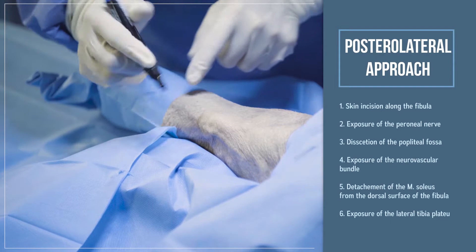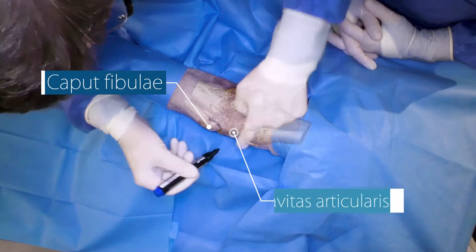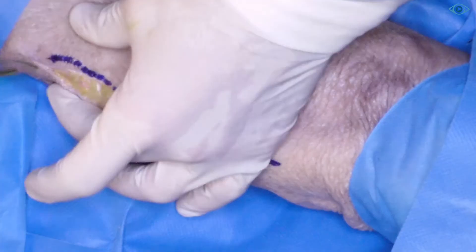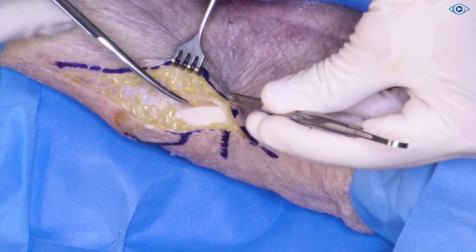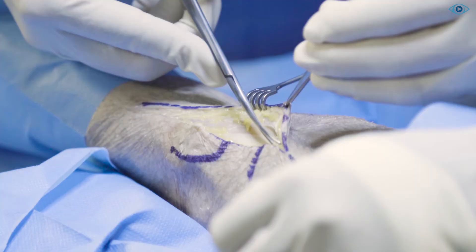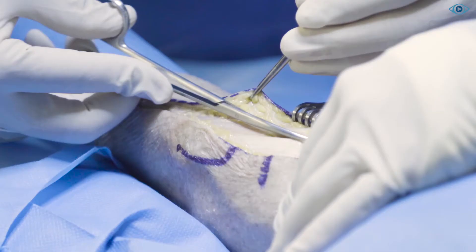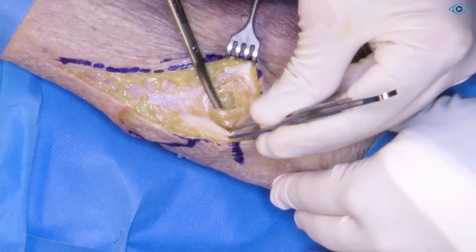Here you see a right knee joint in prone position. Here is the fibula head — I'll roughly mark it — and approximately here is the joint gap at this height. The incision will be directly above the fibula, going till about 10 cm below the head of the fibula. Now we dissect the posterior side of the biceps. You can see the biceps here, the posterior edge. At the right posterior edge of the biceps, we open the fascia, and usually the peroneal nerve appears right here.